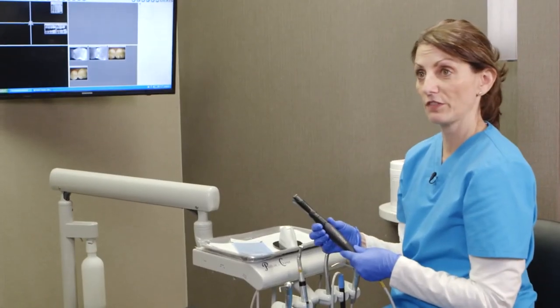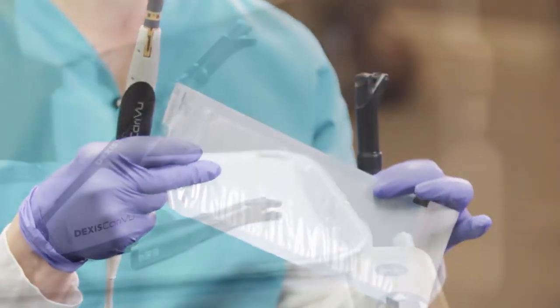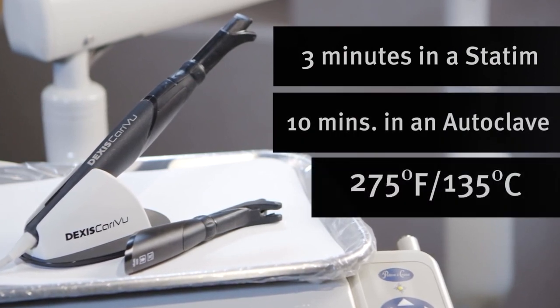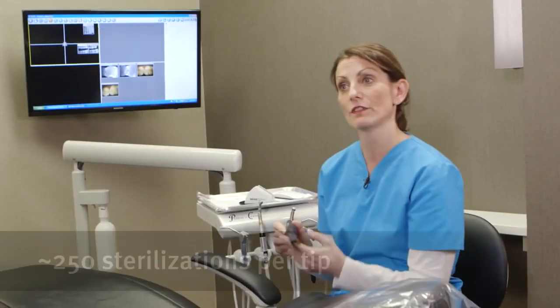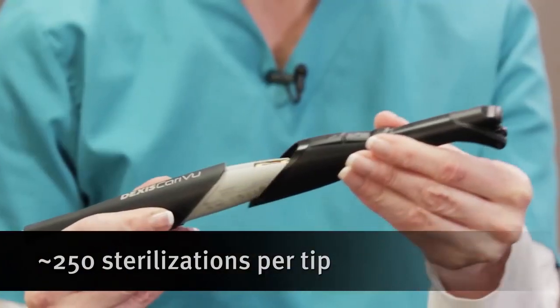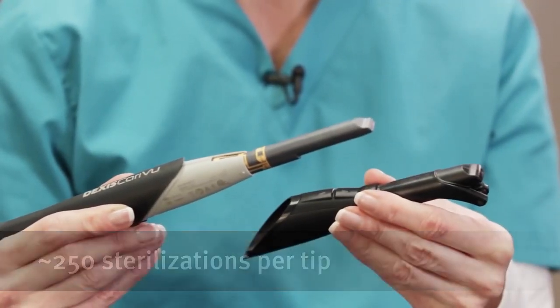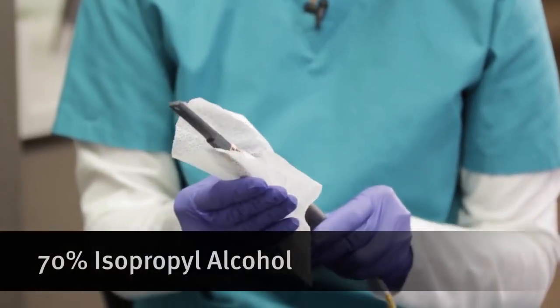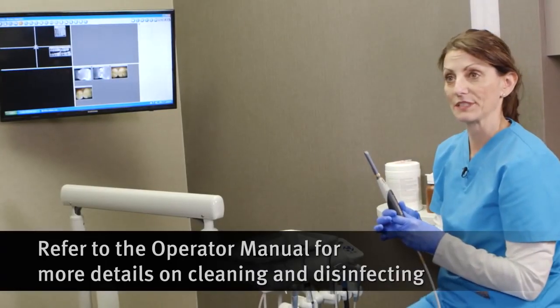Once you're done using the CareyView, all you need to do is remove the tip and place it in an autoclave bag. It's about 250 uses — 250 sterilizations per tip. And then you can use a Cavicide wipe or 70% isopropyl alcohol on the handpiece itself.